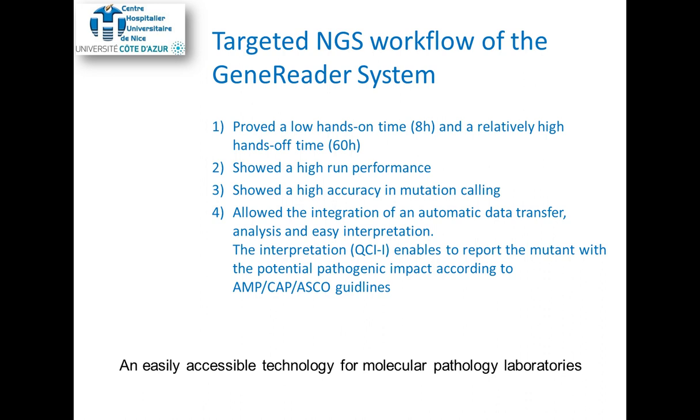For summarizing the second part of the presentation, we can say that the targeted NGS workflow of the GeneReader system has low hands-on time, but a relatively high hands-off time currently. It demonstrated a high run performance and a high accuracy in mutation calling. The GeneReader allows the integration of an automatic data transfer and automatic analysis and an easy interpretation for the team in the lab.